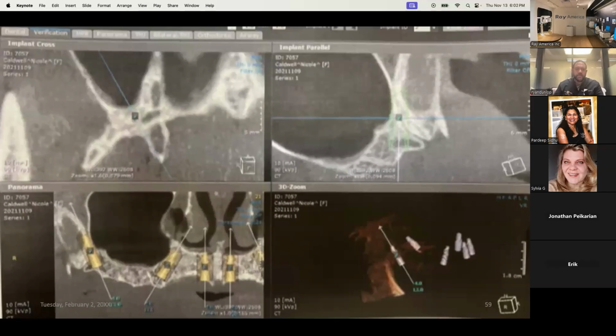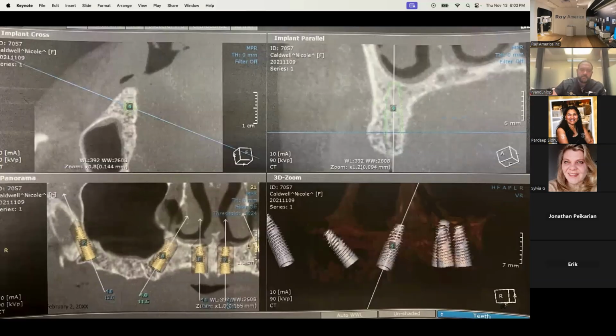So this is just going through some of the scans again and choosing the right implant sites. Again, most of the time, pterygoid implants are 13, 16, or 18 millimeters long. These anterior implants are shorter, so you can see instead of my normal 16 millimeter implant for this site, I'm forced to put an 11.5, which is much shorter. So increasing the number of implants and the remote anchorage for the support is really going to help a case like this.